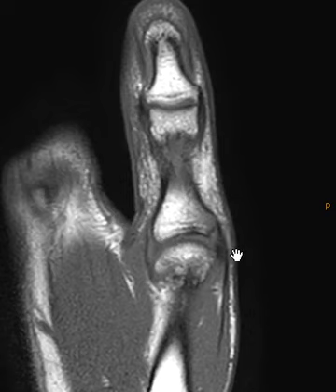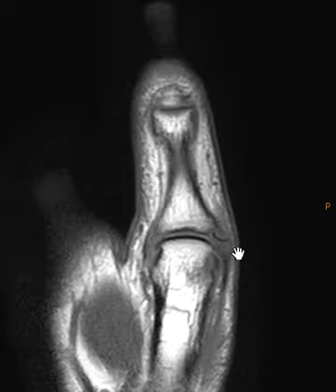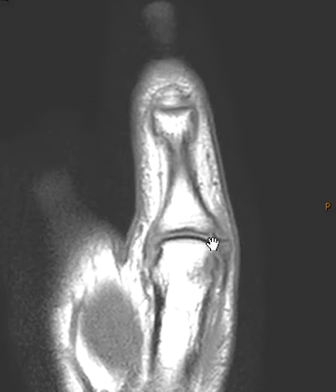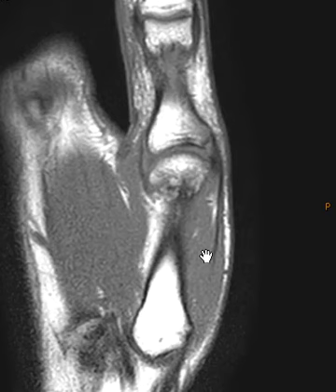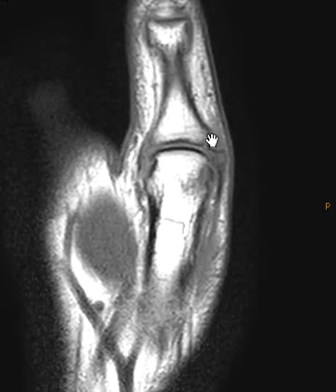And on the radial side, the radial collateral ligament comes off the head and goes to the base here. So it looks like the radial collateral ligament we really don't see very well because it's partially torn, and the patient has an avulsion fracture from the metacarpal head and also from the base of the proximal phalanx here. It's hard to see this, but there's a little horizontal black line, looks like a smile. That's a piece of bone that's rotated downwards, and that's right at the attachment of the abductor pollicis brevis. So this is the abductor pollicis brevis tendon coming across. We're going to see it pass up the head, and it's going to come over here and attach right over here in the base, right up here to attach on this chunk of bone.